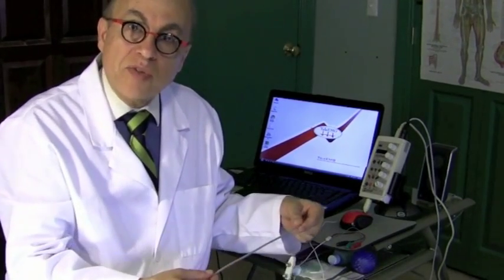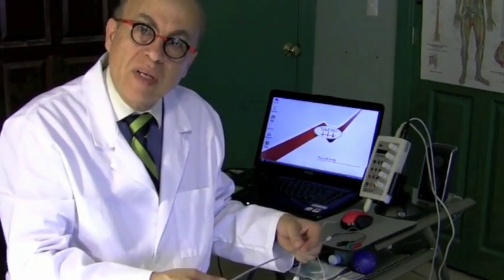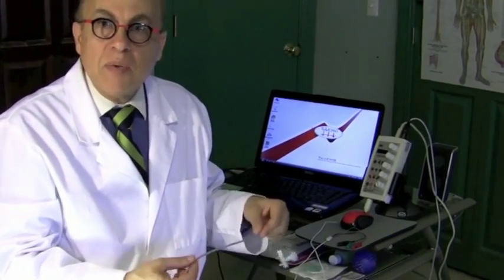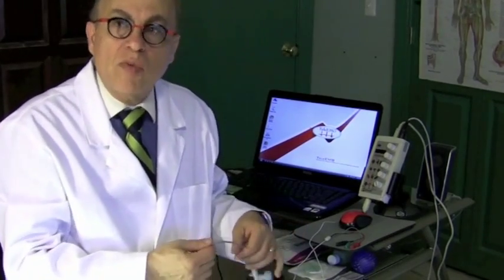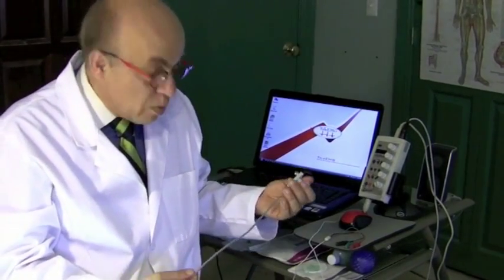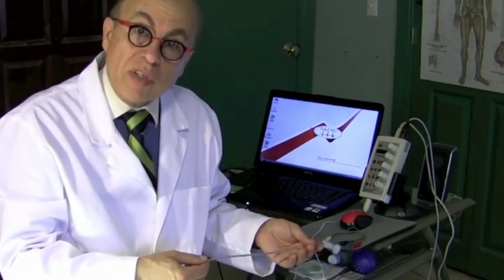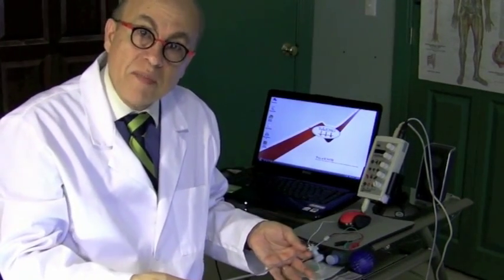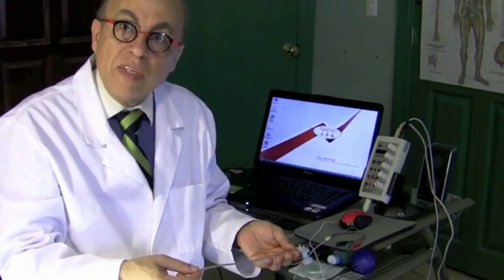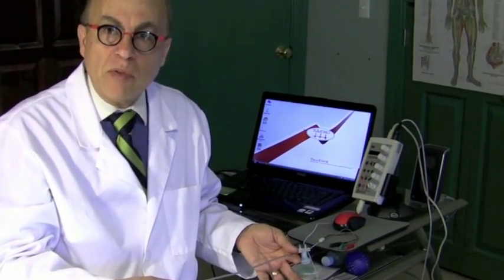When the electricity goes through the nerve, we can see if it's getting stuck somewhere, if it's slowed, if it's not working at all, and so forth. And basically we can determine where it's stuck or where it's slowed, how badly it is, and so forth. Now when we stimulate the nerve, we can record either from the nerve directly or from the muscle that's innervated by the nerve.